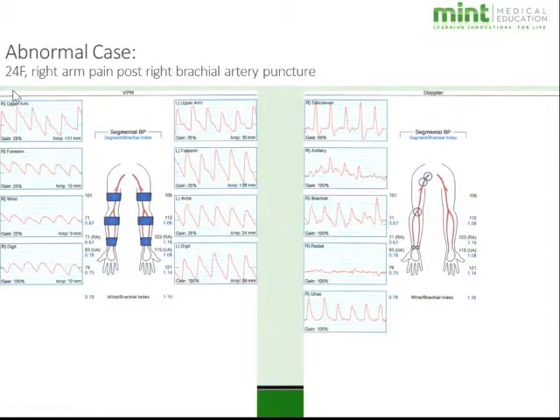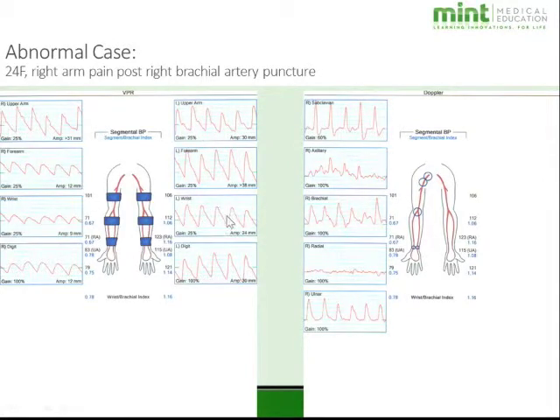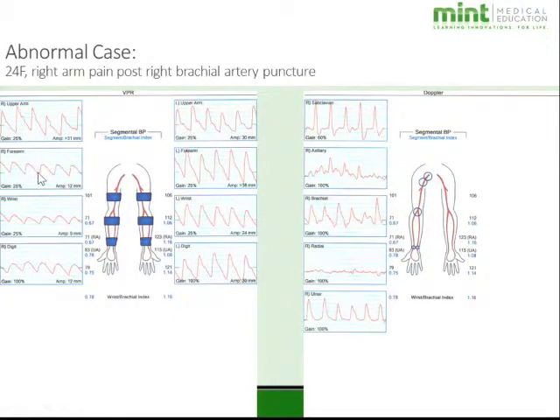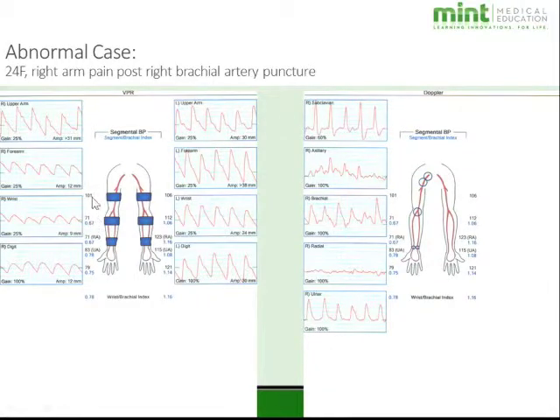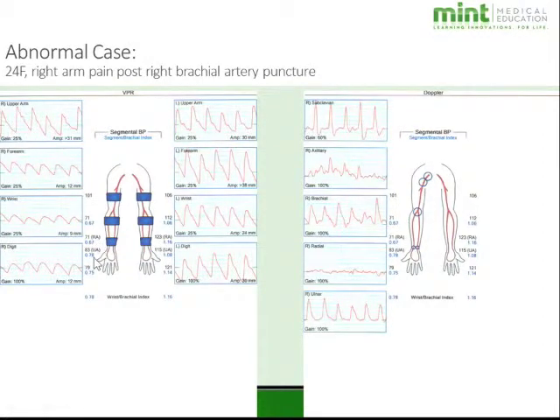Here is an abnormal case: a 24-year-old female with right arm pain post right brachial artery puncture. The left side shows sharp upstroke and notch all the way through with normal wrist brachial indices. On the right side, however, there's a normal waveform at the upper arm but a pretty significant change from upper arm to forearm — a pressure decrease from 101 to 71 mmHg. This indicates an obstruction between the upper arm and forearm as a result of the brachial artery puncture. Her wrist brachial index of 0.78 is below the cutoff of 0.9, confirming it is abnormal.